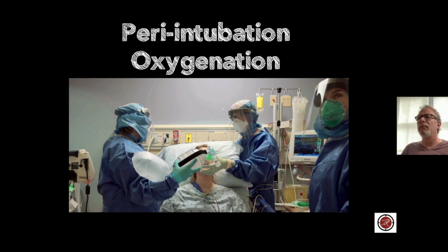Who's in the room? In our place, we have a gaggle of people. And I know in many of your institutions, you're not going to have many people, right? You really don't need more than 3 people. You can do it with 2. Ideally, your assistant is somebody that's familiar with airway management. And if they're not, this is when your teams need to do that, right? They're cognitively offloaded. They'll be able to see things that you don't see. And then having somebody else that's going to administer the drugs, who's going to be your timer in the room. So whether it's another colleague, a nurse, or a paramedic, this is what your team involves.